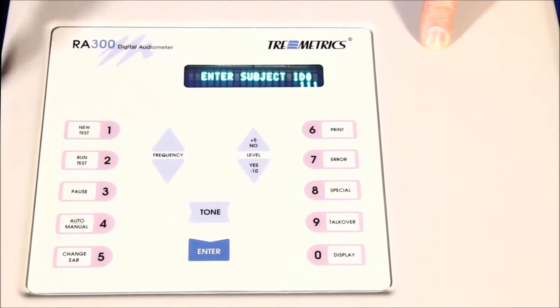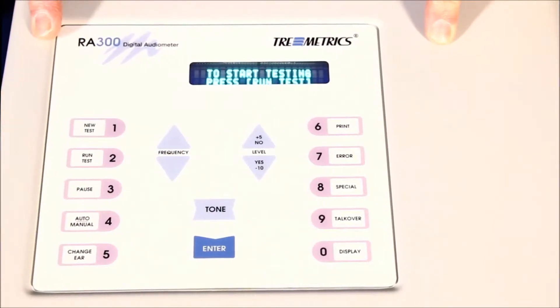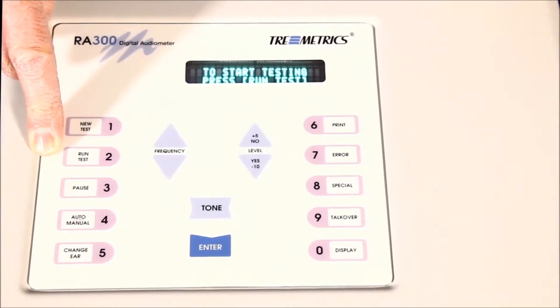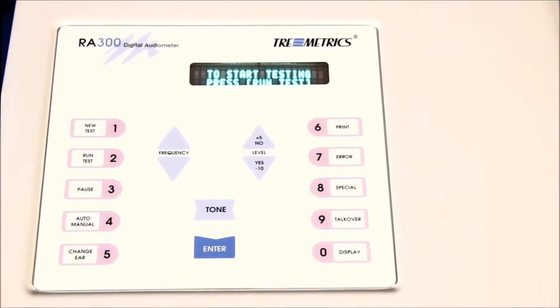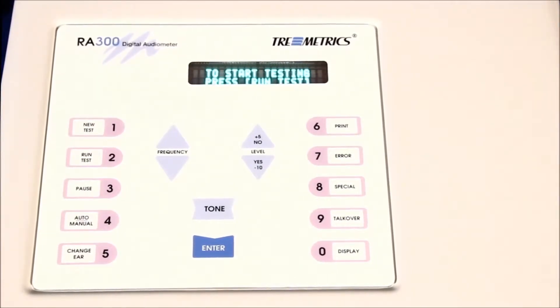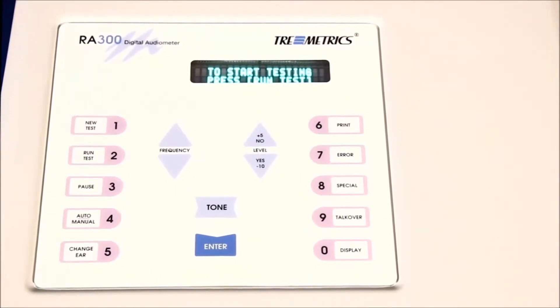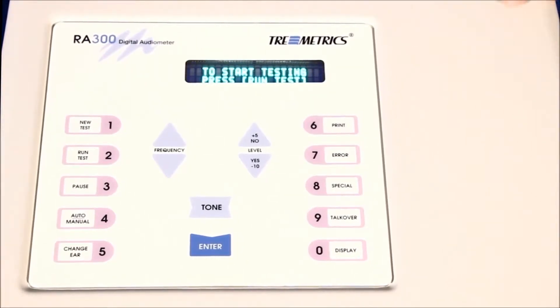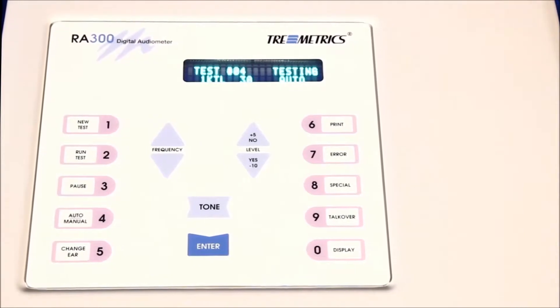I'll put in just a few ones here to illustrate it. You hit the enter button, and now it says to start testing — press the run test button, which is in sequence the number two button. At that point you put the headset on the person and explain the test to them: they're going to hear a series of beeps, loud and soft, some high-pitched, some low-pitched. Whenever they hear a beep, they push and release the button on the hand switch. To run the test, we hit the number two key and the test sequence begins. The tone is presented, you see the tone flashing, and if the person responds, you see the response key.